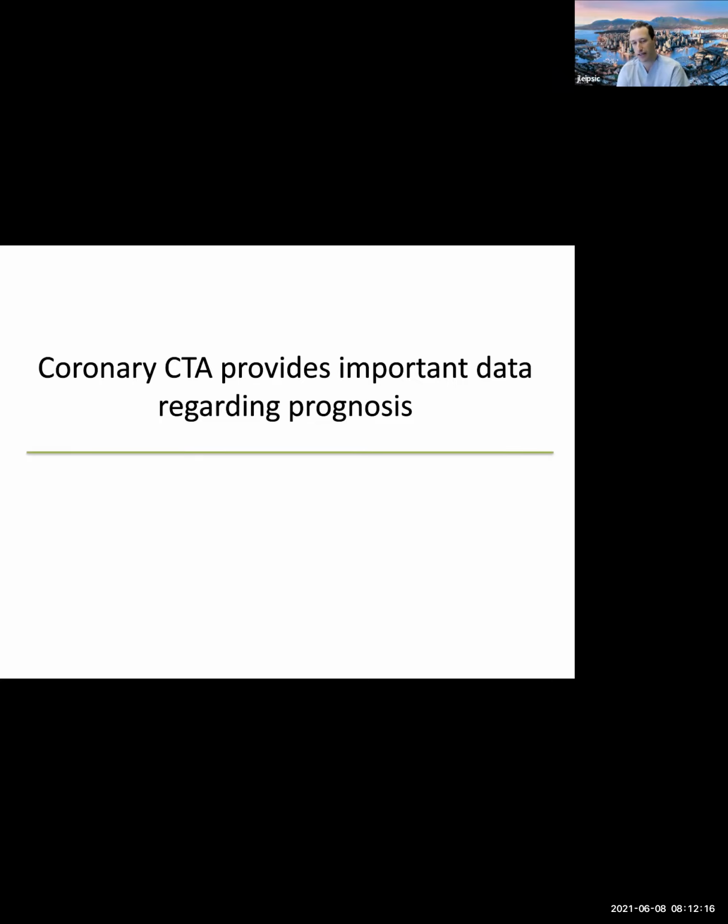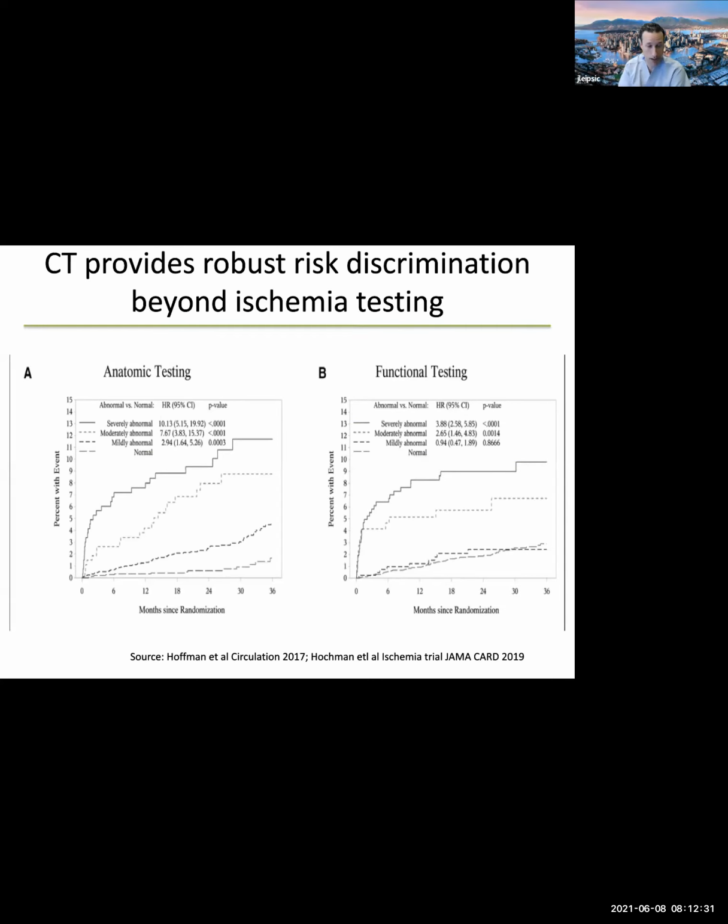But people rightfully at that time said to me, Jonathan, pretty pictures are nice, but at the end of the day, I need to do additional stress testing because I need to really understand the prognostic impact of these findings for my patient. Now, I could give you, I wouldn't, but we could talk, I should say, that was a bit arrogant. We could talk about the prognostic utility of cardiac CT for an hour. There are endless manuscripts that have explored the prognostic utility across various populations across the globe. But I'm going to share with you two slides that I think really drive home the key incremental value brought forward by a coronary CT as it relates to risk prediction.